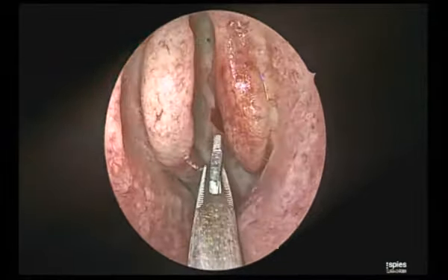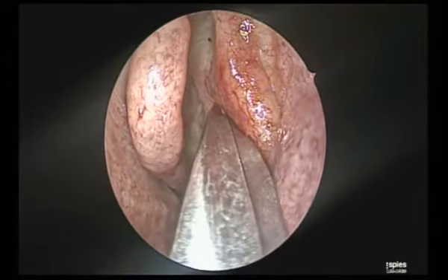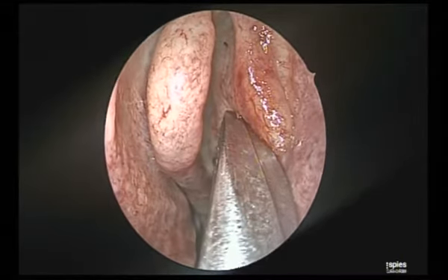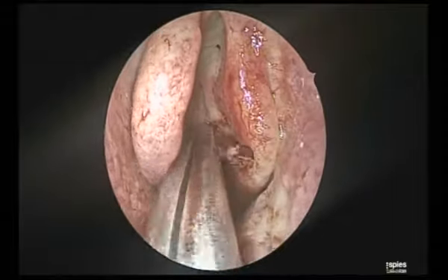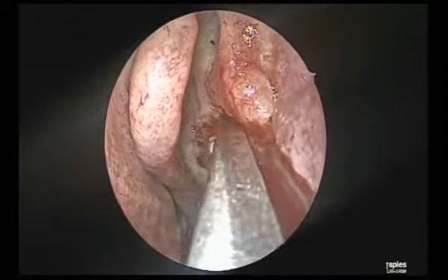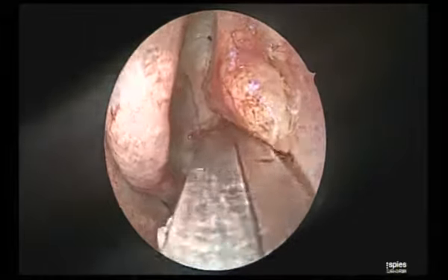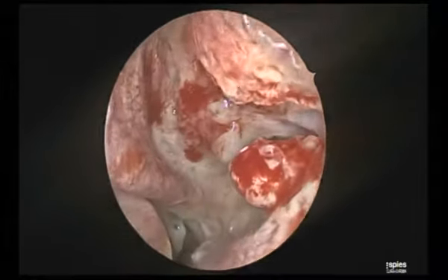See, my technique is to use a reverse biting forceps, go into the hiatus semilunaris, and turn it a little downwards. That is the important thing I always ensure, and bite through. Don't remove that. Go further. This uncinate is a little everted, you can see. Now I will bite through until I reach the hard bone, then I will not do anything.